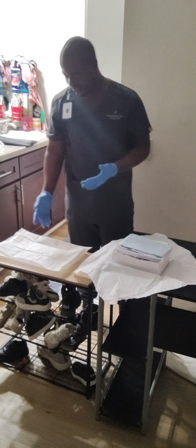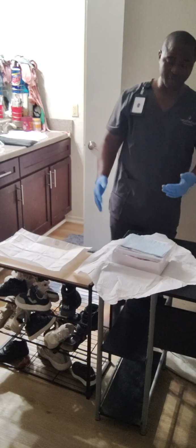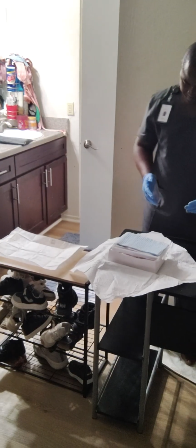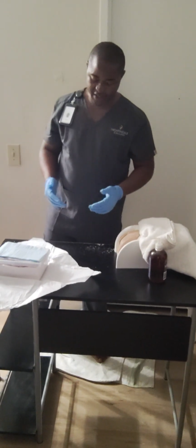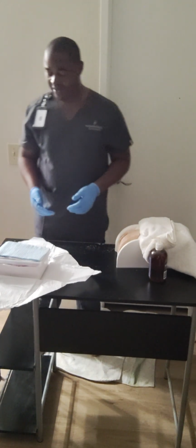I can move this to the side, but I'm just going to let it sit there. So right now, I'm going to pick up my blue drape and ask my patient to lift up so I can put it under them with the shiny side facing down.